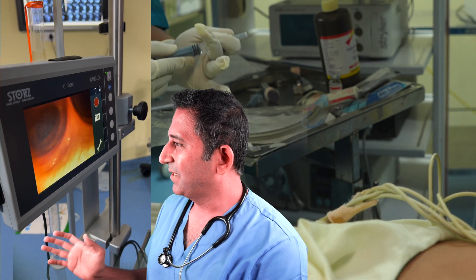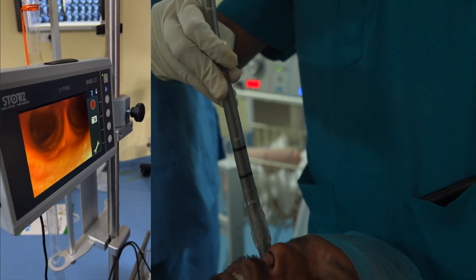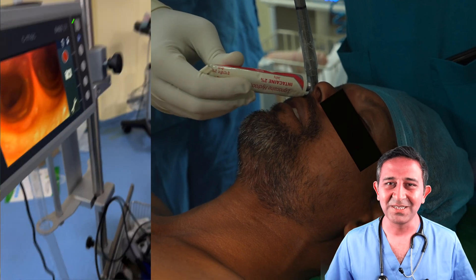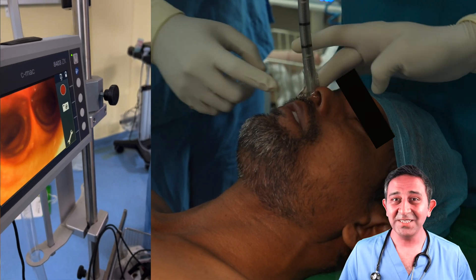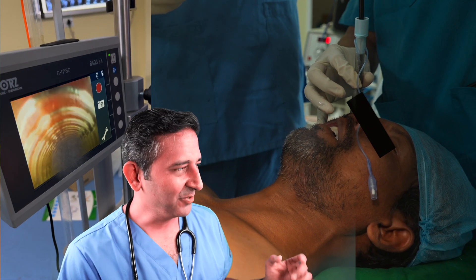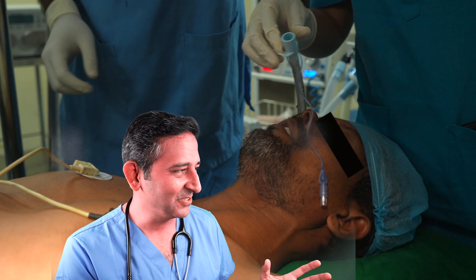This is the scope entering the trachea, or the windpipe. As this is going on, the patient does not feel anything because the patient is kept deep under anesthesia. There is some lubricant placed so the tube goes in easily. Now the scope is in the trachea, and the breathing tube is actually pushed into the trachea. Here is the scope being pulled out as the tube is inside the trachea.